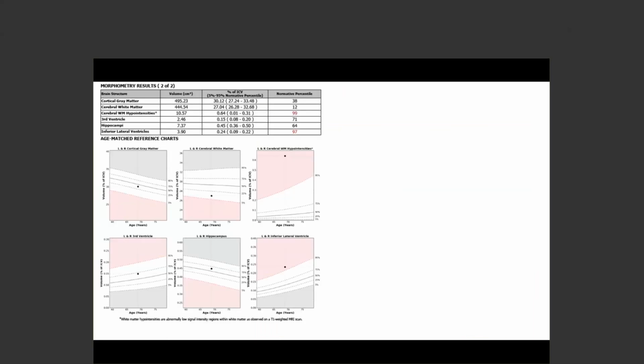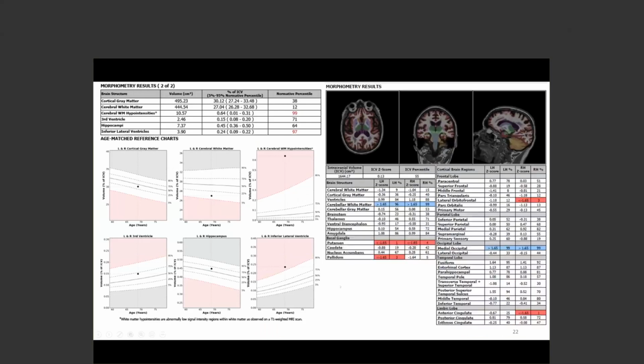As far as quantification, this is a tool that we did not develop, but we have implemented here, just to give you a sense of how complex this can be. This is based on an MRI T1 without contrast. You can segment all the brain parenchyma and several of the lesions, and then report the volume of each one, and try to assess whether there is an asymmetry between the structures, whether that falls outside of the normality for that patient's age. And as you can see on this slide, there's a tsunami of data that AI can produce, and we need to have the right integrations to be able to consume that data.